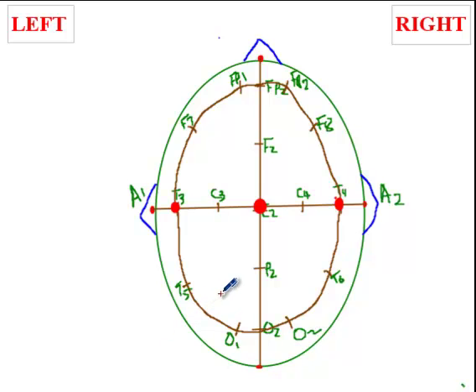Now, we have to fill in a few more electrodes. So, we measure the distance between FP1 to O1, but passing through C3. So, you go from C3 and terminate at O1. And likewise, you start from FP2, measure through C4 all the way to O2.